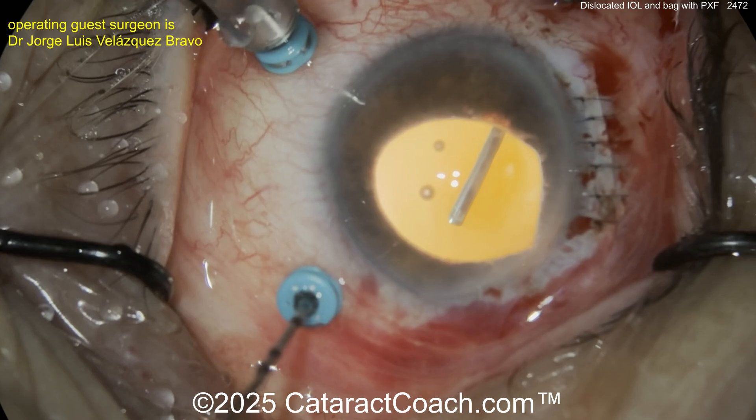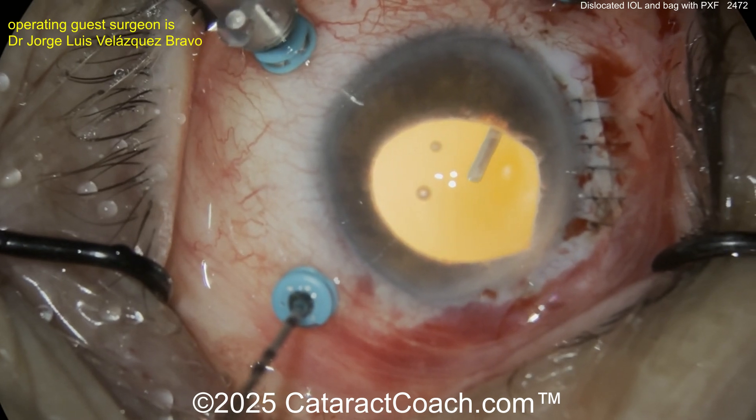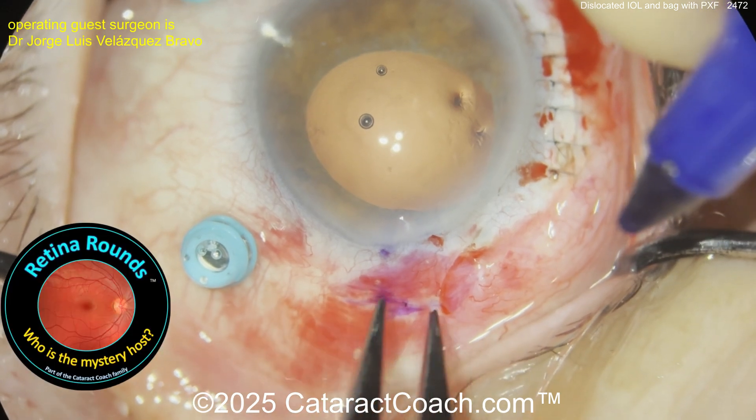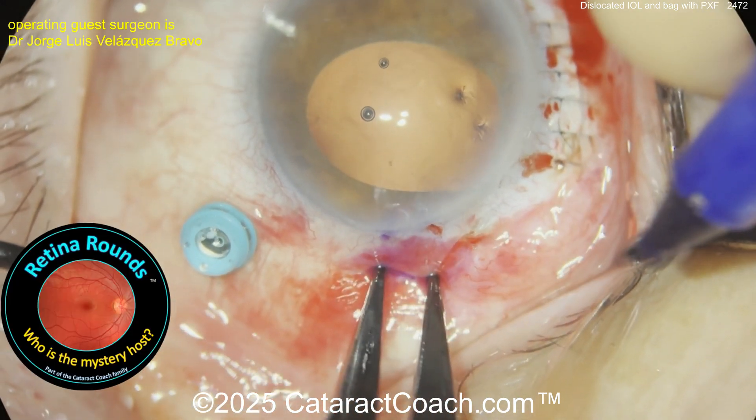That incision was sutured up. Now a pars plana vitrectomy — very nice. This is helpful especially if you want to learn retina. Check out retinagrounds.com.